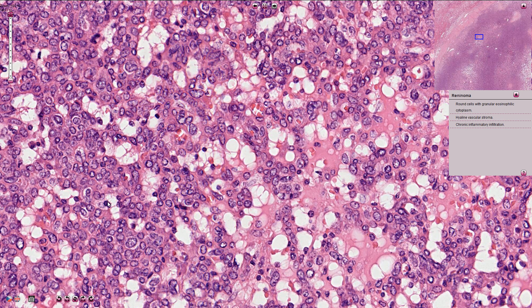The tumor can sometimes morphologically resemble glomus tumor, and glomus tumor is also the main differential diagnosis. Immunohistochemistry and clinical details often help to differentiate these two entities.